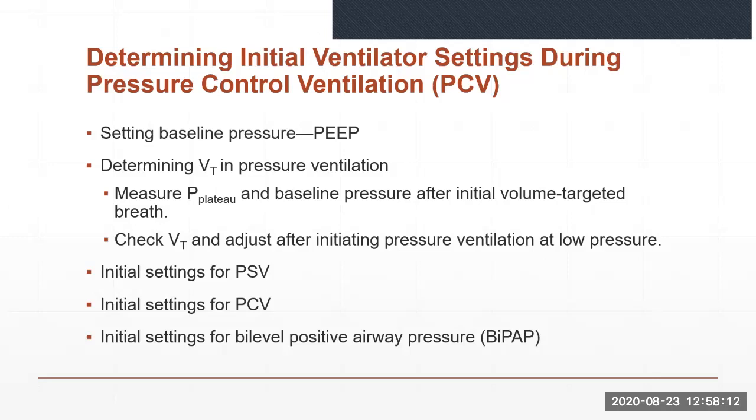pathology. Expiratory positive airway pressure, or EPAP, or PEEP, is initiated at 2 to 5 centimeters of water pressure and increased in increments of 3 to 5 centimeters of water pressure. The initial FiO2 is set to ensure adequate oxygenation. It is important to recognize that initiating NIV may require a considerable amount of time to achieve patient compliance.